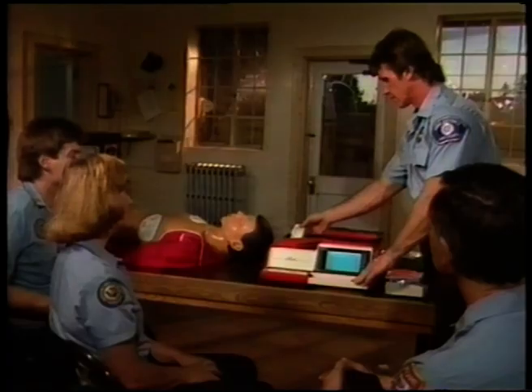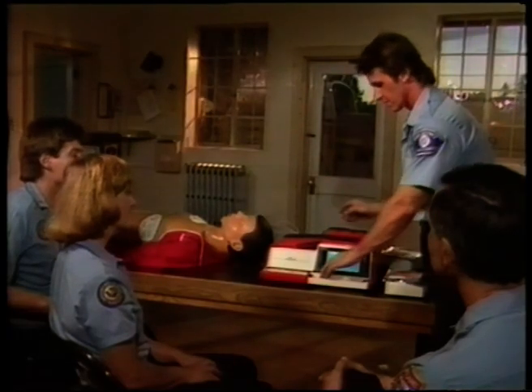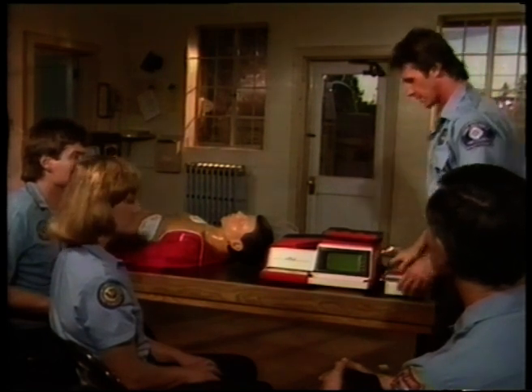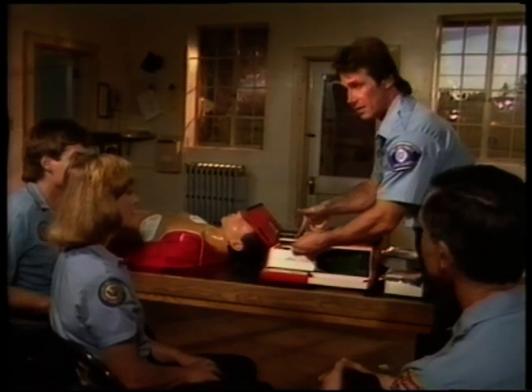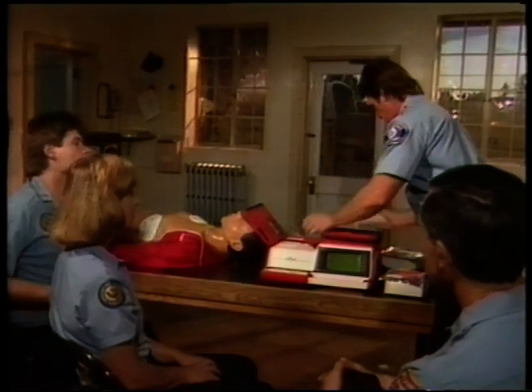After every use, create a code summary critical event record. Don't forget that this information is erased 15 minutes after the device is turned off, so you must make a record before then. Discard used fast-patch disposable defibrillation electrodes, including electrode sets that were open but not used, because they dry out in less than 24 hours. Remove the recorded cassette tape, label it, and forward to your medical control. Place a new blank cassette tape, or one that has been completely erased, in the deck with the full reel of tape on the right side of the deck.